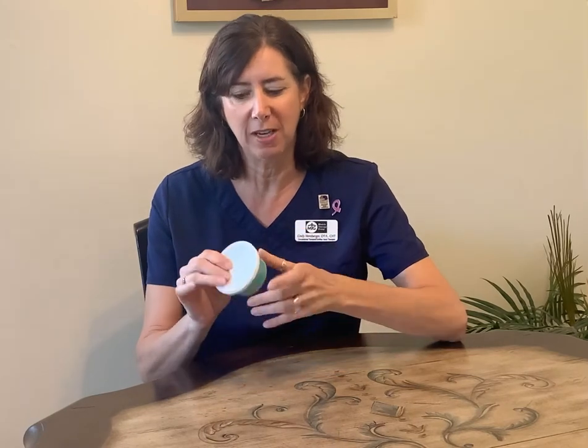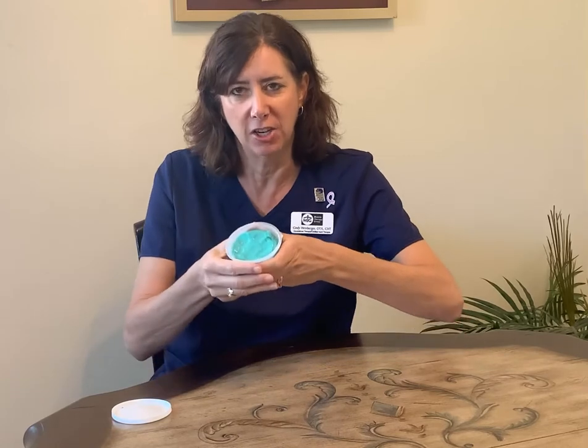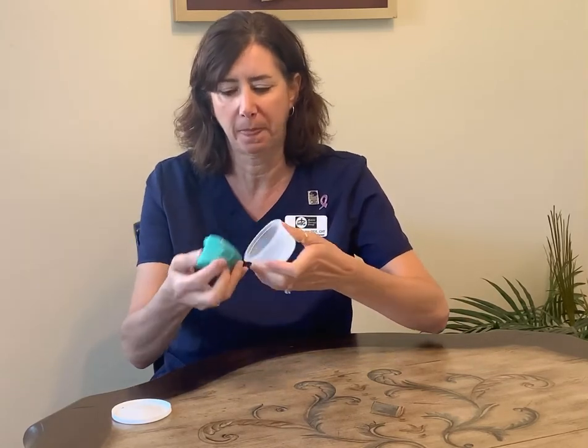Wanted to talk to you today about Theraputty exercises. So first of all, when you take the putty out of the container, it's going to be all stuck to the sides. You're going to have to squeeze the edges to get the putty out.